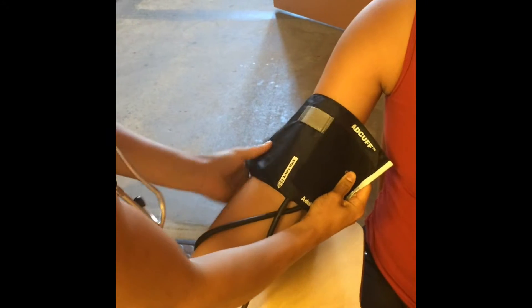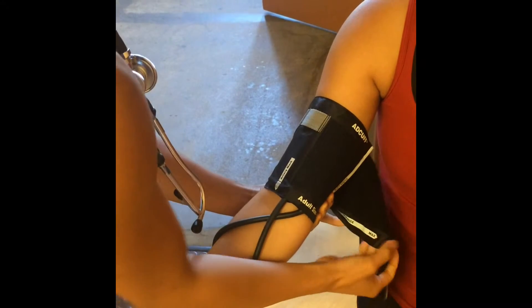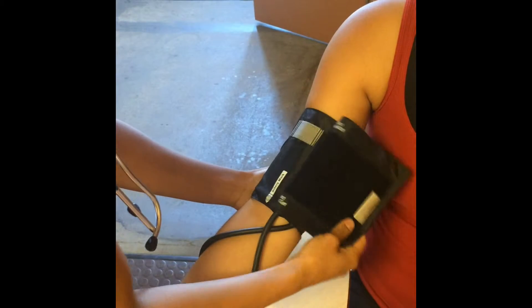Align the cuff with the brachial artery. The appropriate cuff size must be used to ensure accurate measurement. The bladder within the cuff should circle at least 80 percent of the upper arm. Many adults require an adult cuff.